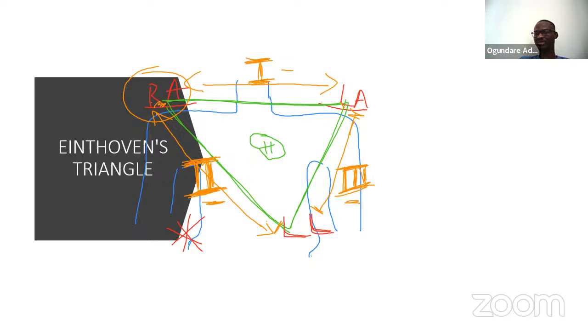So you don't have to be exposing the patient and walking your way from V1 to V6, going right hand, right leg, and just going over like a Christmas chicken. So you already have an understanding, you have a focus in mind, you know where you need to check when you see that.